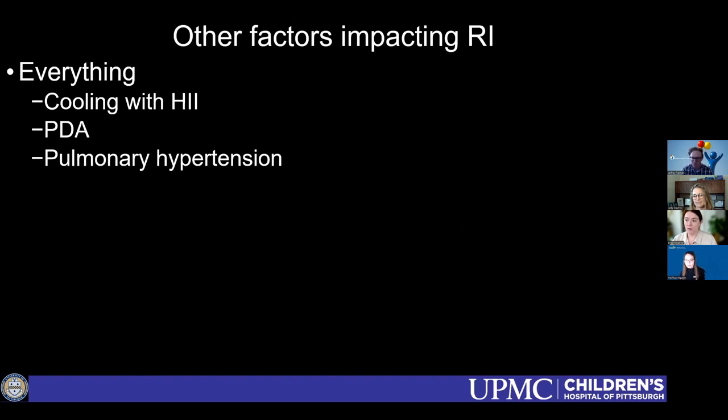Is that a separate code, or is it mainly just within your technique, saying like using grayscale, color, and then spectral analysis? For us, the coders look at our technique to see if everything matches.